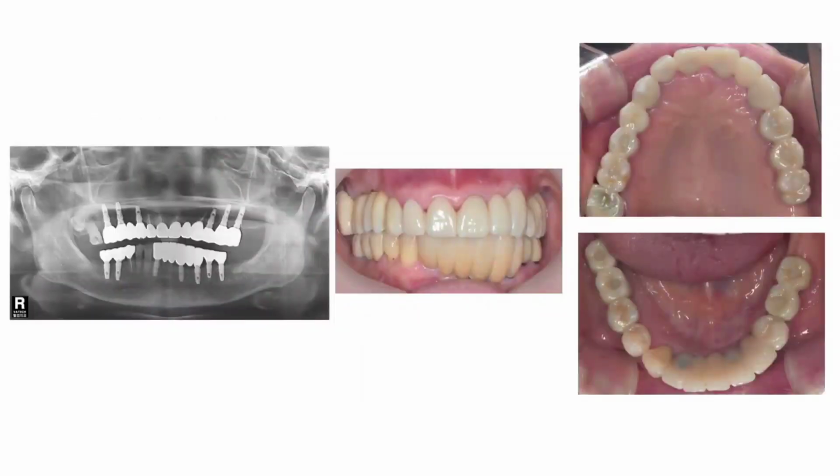The panoramic radiograph looks a bit distorted because the patient's head was lifted a bit during the x-ray, but still, you can see that the occlusal plane was determined sufficiently.